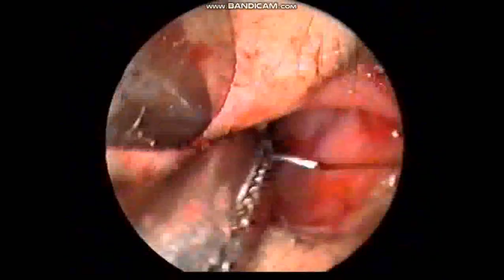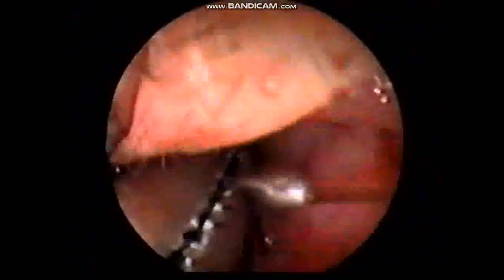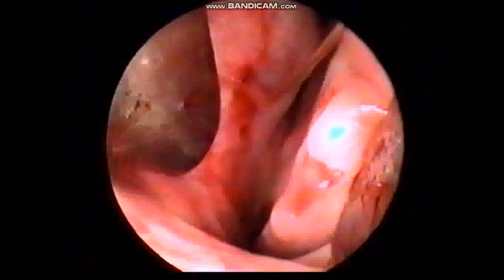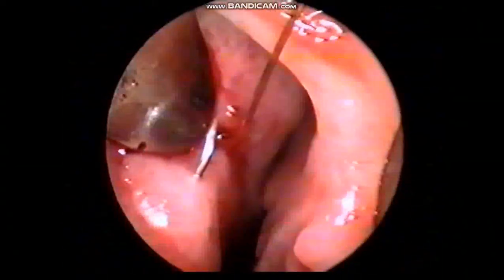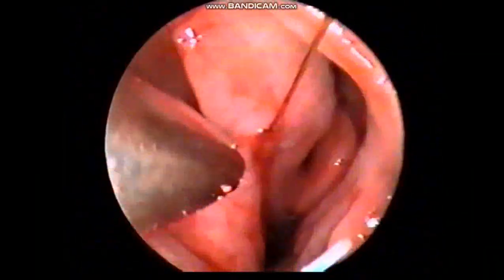Now again take it from this side to the opposite side, at an inferior level. Now the cartilage will be tightly adherent to the mucoperichondrium of both the sides.